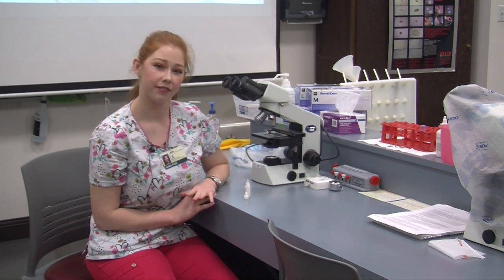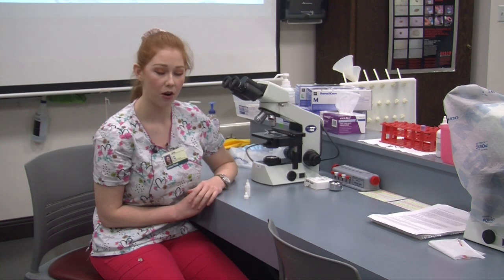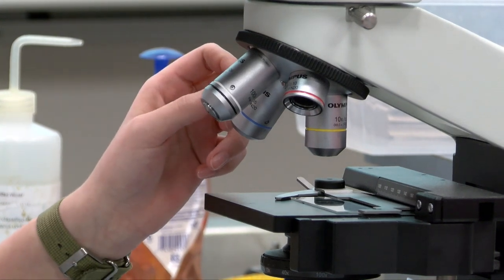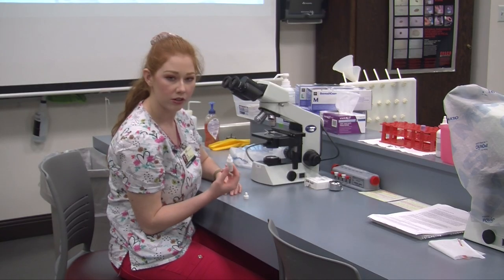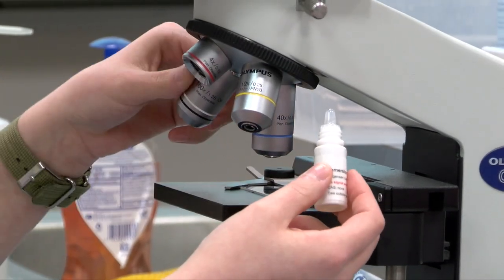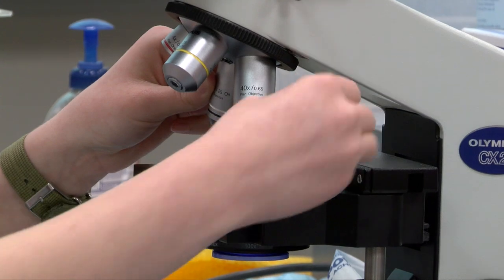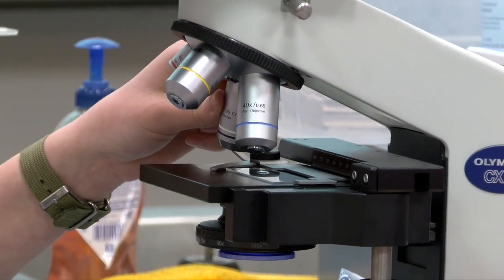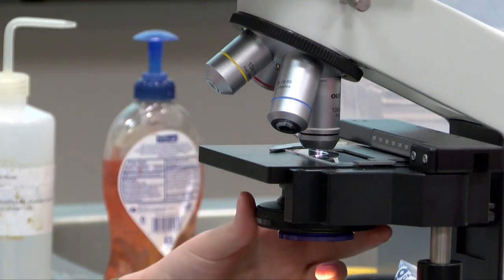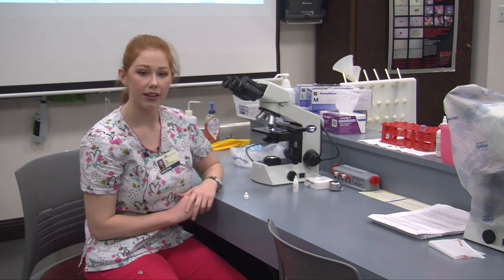After we decipher if our patient is positive or negative for Microfilaria, we can move on and check out our white and red blood cells. When we do this we want to switch to a hundred times oil immersion, but we have to use immersion oil in order to visualize these cells. We place the immersion oil on our slide, then switch objectives, making sure our diaphragm is on a hundred times with the condenser up and bright light.